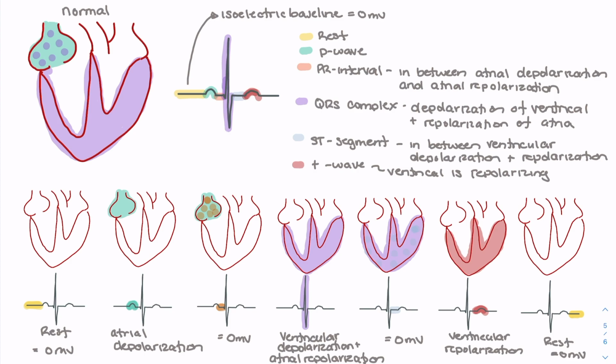So a few things are a little bit different. Here we have a ventricle that's at rest, and that's why we see a net flow of 0 millivolts. When we look here and here, it's not that the ventricle or the atria is at rest, it's that we've had depolarization happen in one of the chambers of the heart, and we are now waiting for repolarization. So ions and electricity have moved, but now the net flow is zero.